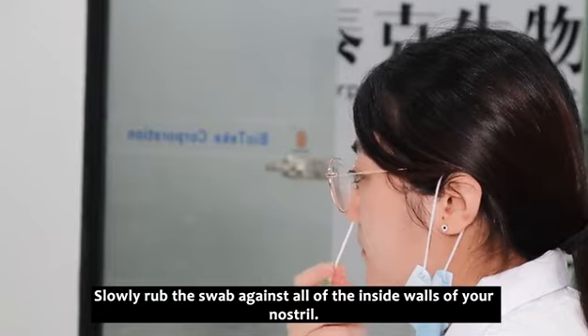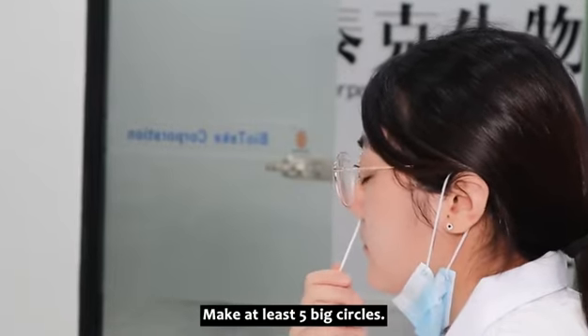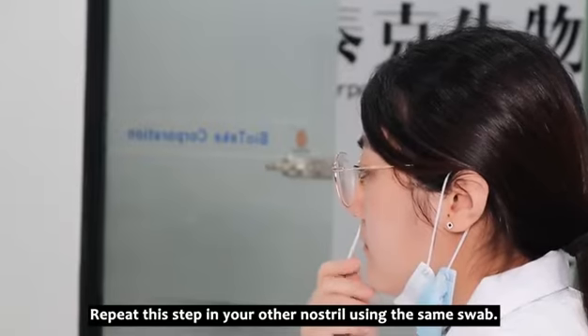Slowly rub the swab against all of the inside walls of your nostril. Make at least five big circles. Repeat this step in your other nostril using the same swab.